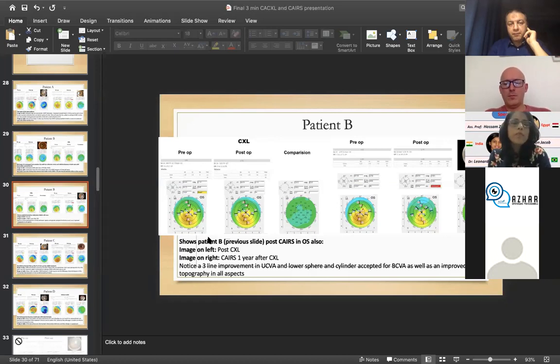About the optic zone, as I said, the closer you come, the more effect you get. And if you decrease the arc length, you get more effect on the astigmatism rather than on the sphere. So you can actually use all of these. We've got trephines, and these trephines are manufactured in India. If anybody would like more information about this, please email me. My email is on the opening front slide of all my YouTube videos. If you're interested in starting this off, I'll help you with the nomograms for the trephines that are available and help you in acquiring those trephines as well.